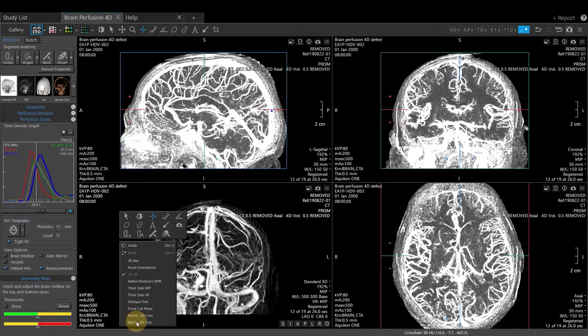If non-DICOM data is requested, choose Movie 4D Cine, which will generate an AVI file that can be saved locally.